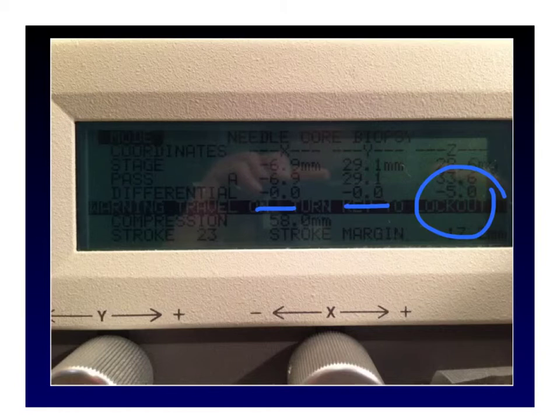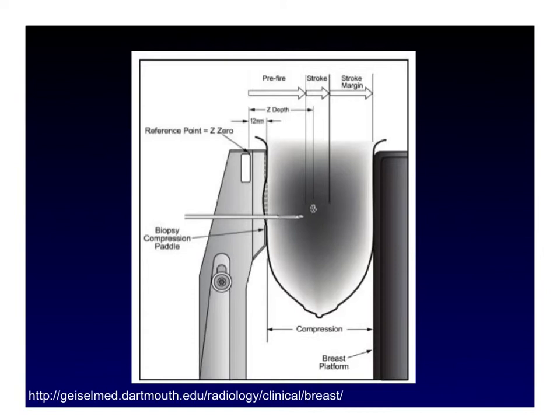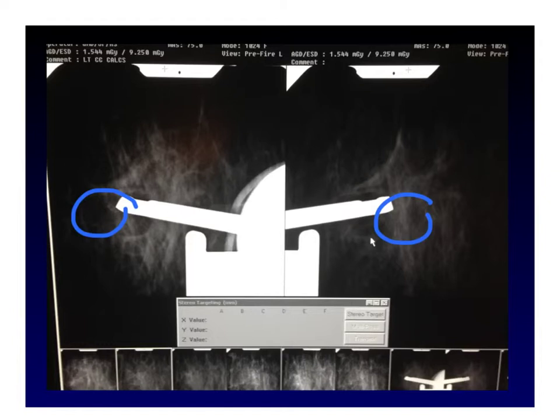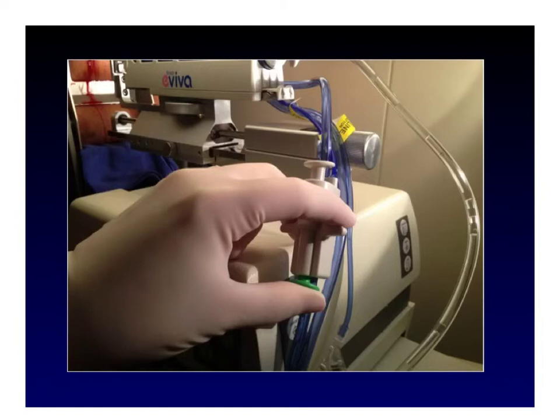Our biopsy device is now in the pre-fire position, five millimeters proximal to the target lesion. We take pre-fire stereo pair images, and we see the calcifications are largely equidistant from the needle tip. There are times when the target may appear further away on one view, which may require repositioning — troubleshooting for that is beyond the scope of this video. We then deploy the biopsy device by pushing the green button. The distance the needle travels after firing is called the stroke. Once fired, the target will be in the center of the well, and the distance from the needle in the post-fire position to the back plate is called the stroke margin.